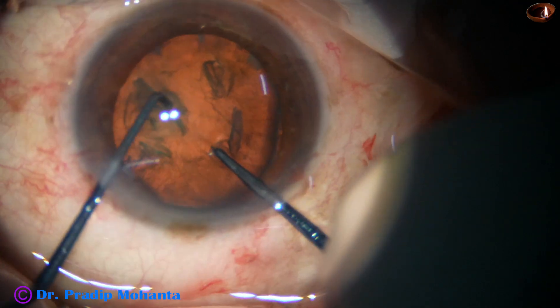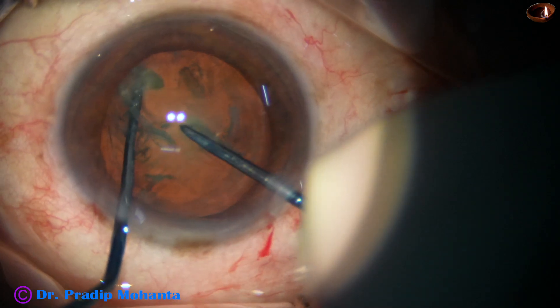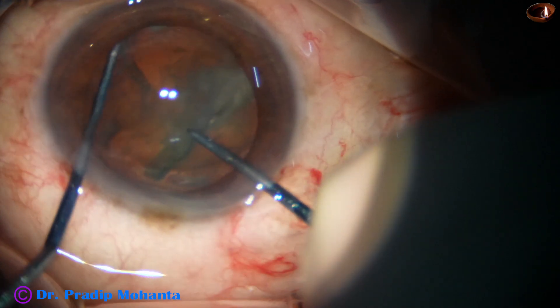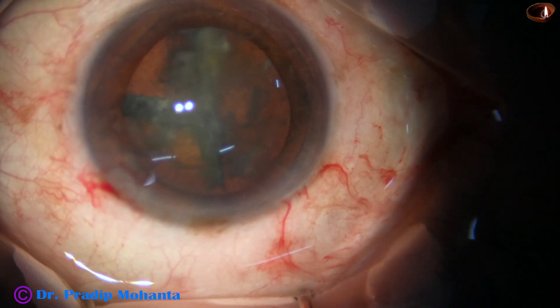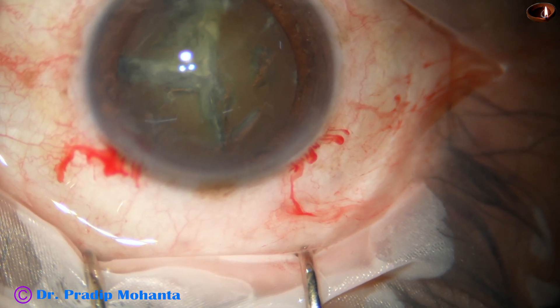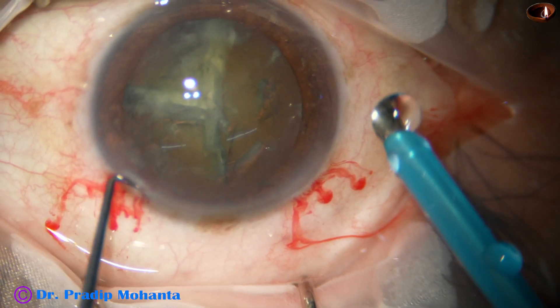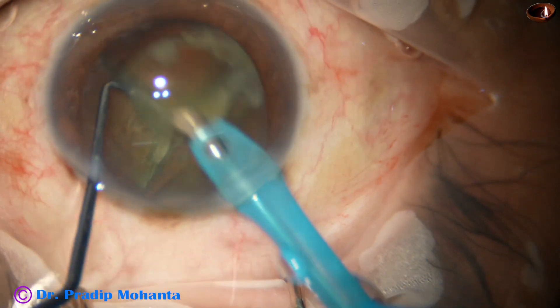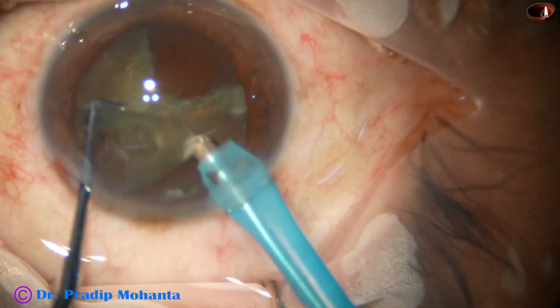Viscoelastic is used to fill up the anterior chamber and now the pre-chopper goes in. The pre-chopper is embedded in the lens cataract substance. The sustainer hooks the opposite equator. The two are brought to each other and we divide the nucleus into two hemi-nuclei. Now we divide 90 degrees and cut one hemi-nucleus into two pieces. The handpiece then goes into the anterior chamber with its bevel down.